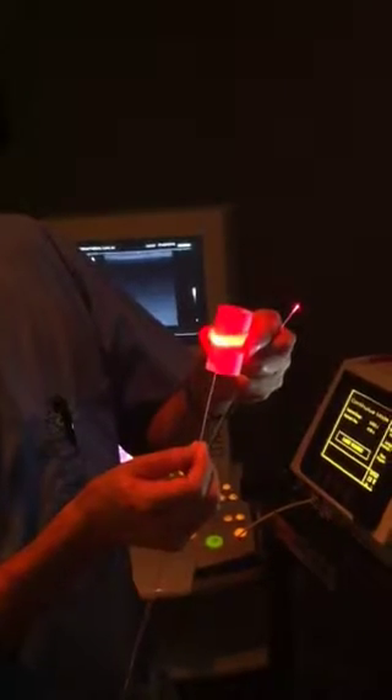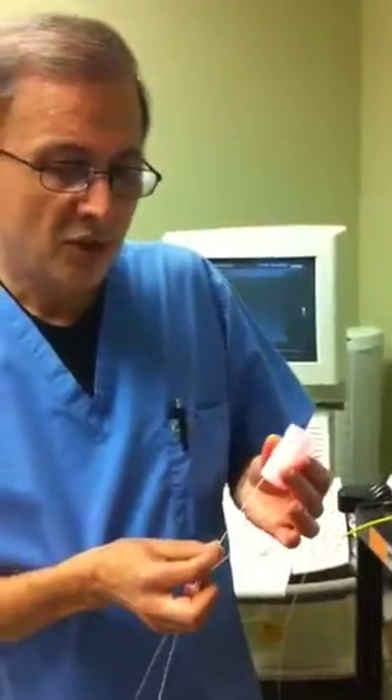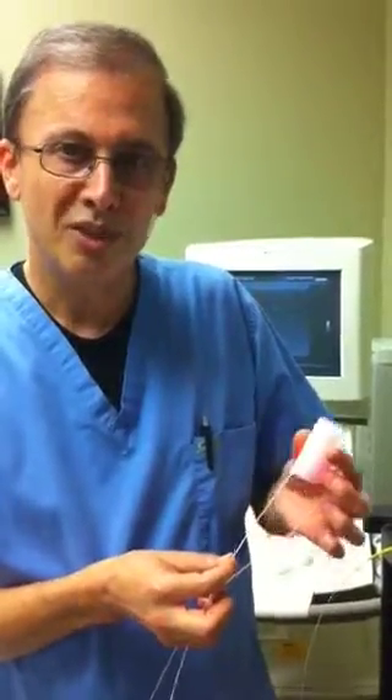As we go into the vein and pull out at low energy very uniformly, we will damage the endothelium of the target vein, and that results in better results and more success rates. As mentioned, the patients do not have much pain with this system, so this is our preferred method of treatment. We are happy to be the first vein clinic in the San Francisco Bay Area to offer this to our patients.